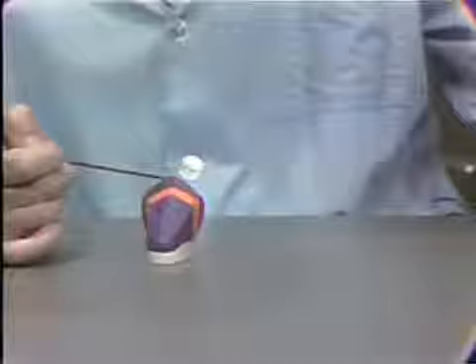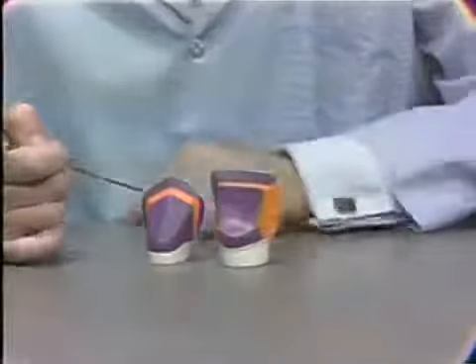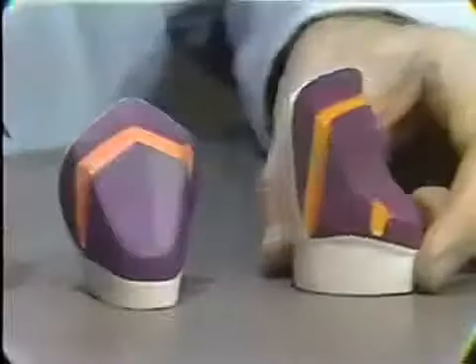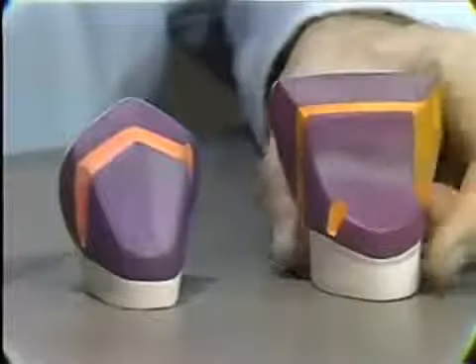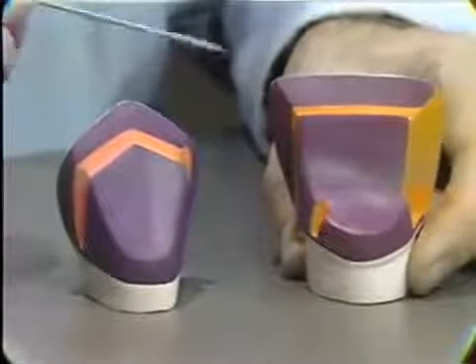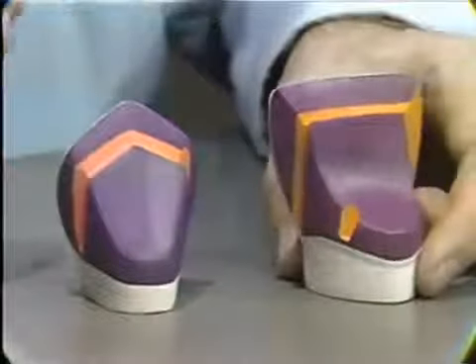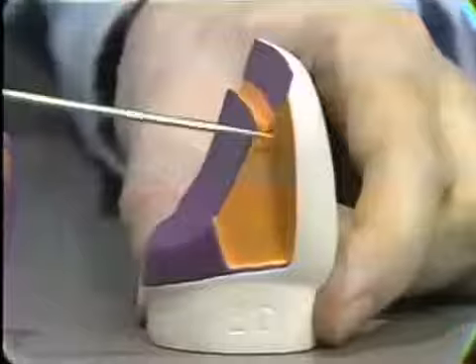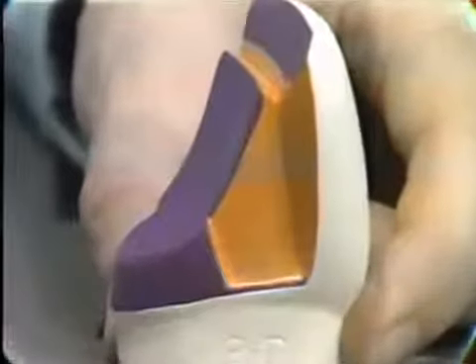You should, however, be familiar with these because you may come across bridges that have been in position for some years in which this type of preparation has been used, and you find yourself having to work with it and to repair it. Another modification of the standard three-quarter crown preparation is shown here, in which a box replaces one of the proximal grooves.